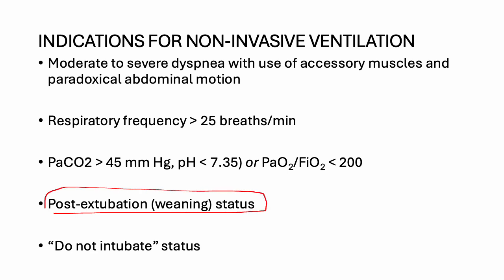And this particular point: sometimes when the patient is being extubated, removed from the mechanical ventilator, but they are not doing well breathing spontaneously, they may have more dyspnea, increased work of breathing. Then the physician or the team may start the patient on non-invasive ventilation, as opposed to intubating the patient again, to see whether the non-invasive ventilation can help to tide the patient through this post-extubation period, and therefore save the patient the trauma of being intubated again.